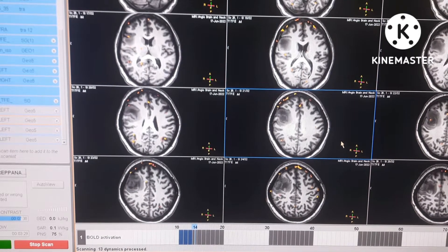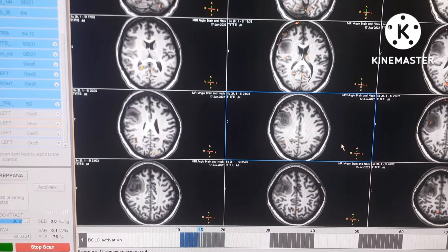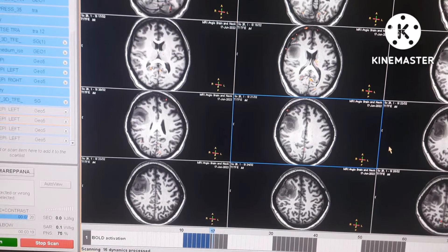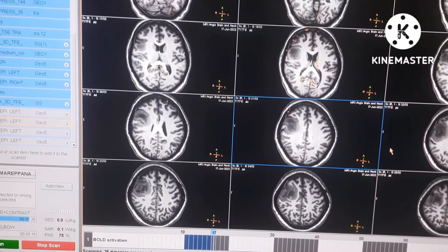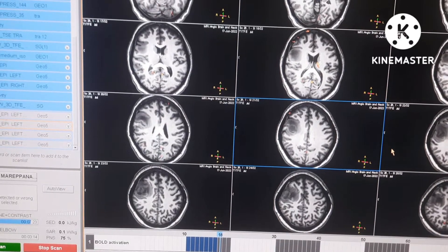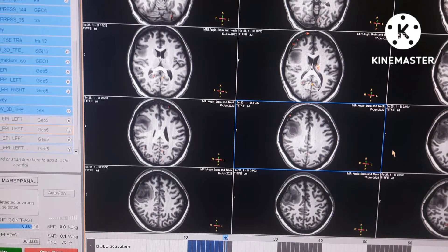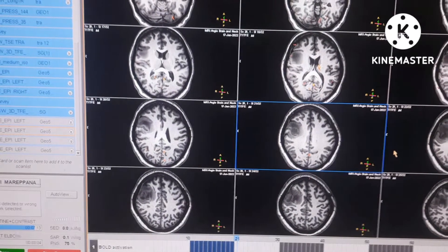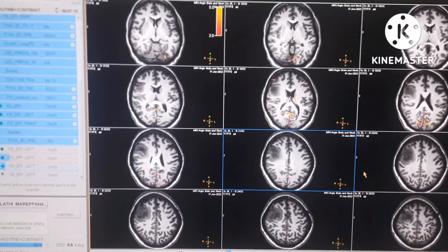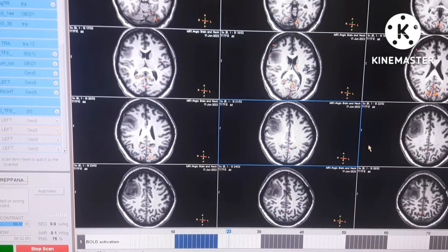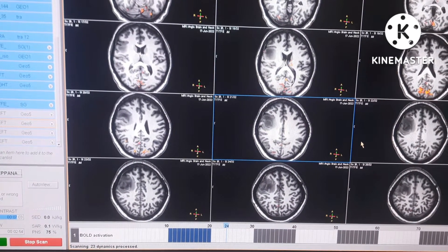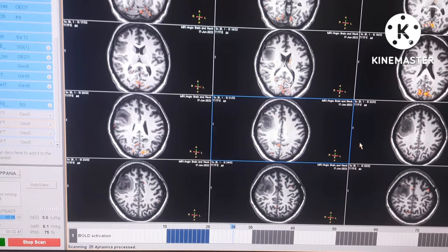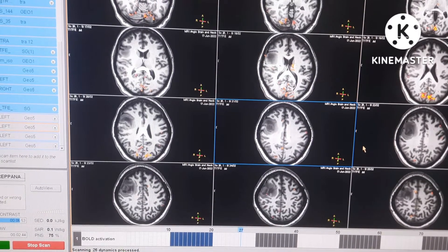After dynamic 10, you have to make the patient move. You can see from dynamic 10 to 20 the patient has to move their upper limb. For the left elbow, the patient has to move during the scan, and after dynamic 20 the patient has to rest. You have to follow the rest-movement-rest-movement pattern. Now the patient is in rest condition.